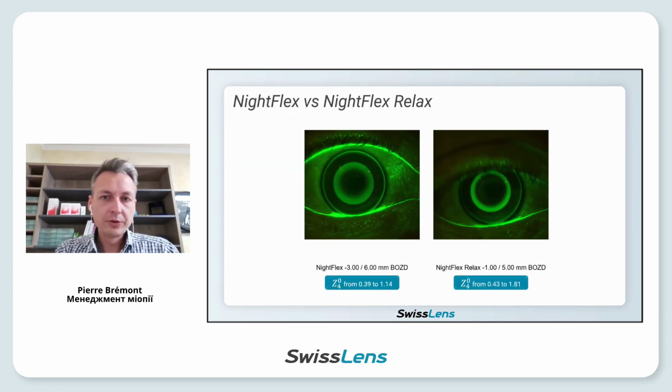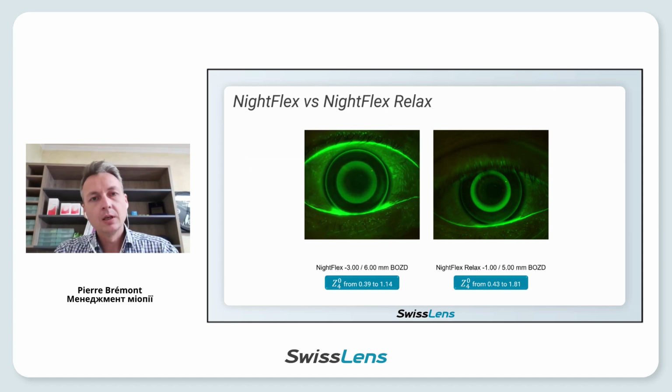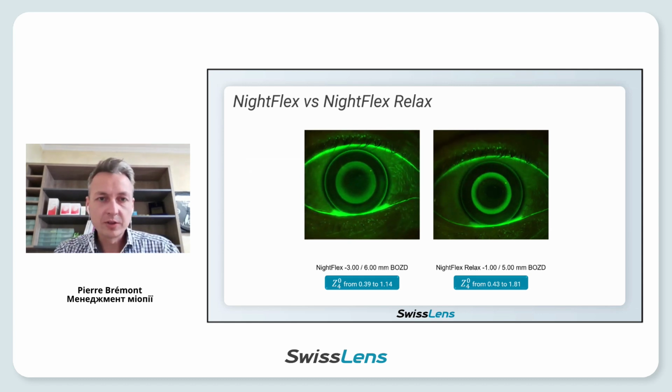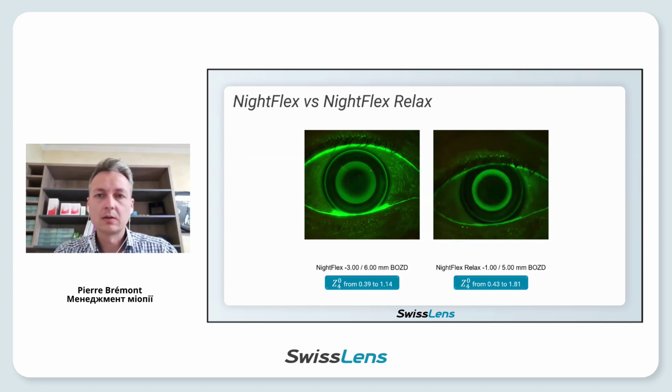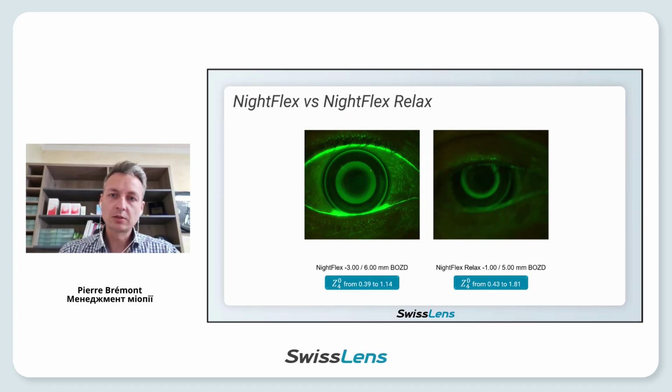If we look at the fluorescein pattern, on your left, a standard Nightflex with -3, with a smooth transition from the center to the mid-periphery in fluorescein. And on your right, you have Nightflex Relax with only -1. So a lower myopia, but a much sharper green ring around.